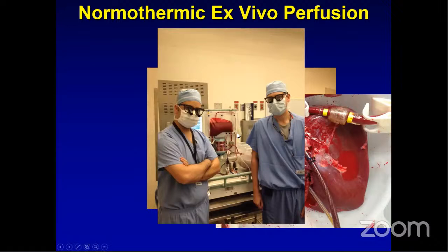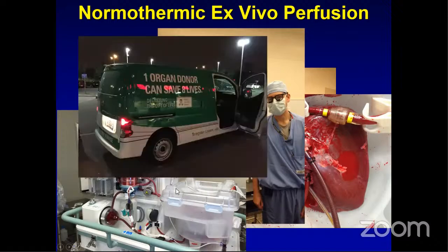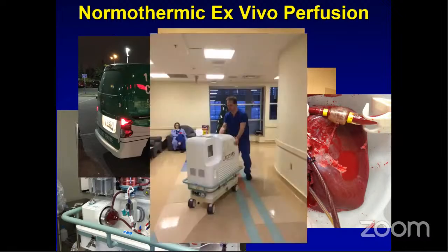You see the machine in the background perfusing the blood around. Here's a reservoir. It goes into a circle, and the liver is in this box over there. Again, the liver is on the pump in this box, and the machine can be covered afterwards. We bought a van to transport this machine. The machine is transportable, not in planes, but it can be put in cars. So we have an extra car for this. The machine weighs about 100 kilograms and needs an energy supply, so we bought a car that gives all the required plugins. And then we're rolling it around.